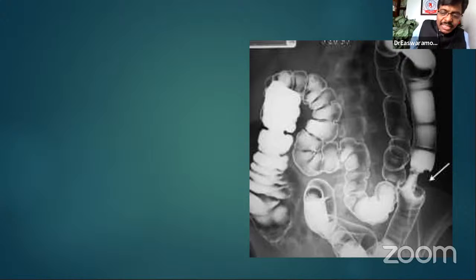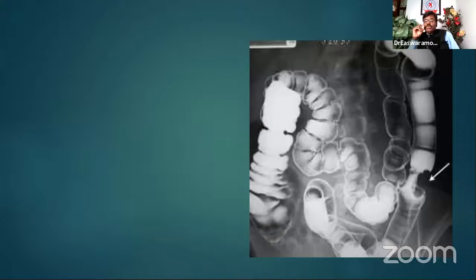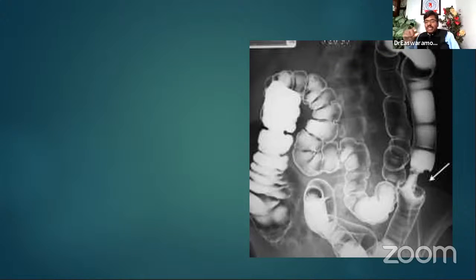Why? Can you do a CT scan tomorrow in this patient? No, sir, we can't do it. Okay, so you have to wait, five or six days, for CT. If the patient comes tomorrow with this picture, you tell the patient, because of barium, I can't do any investigation for that matter. You give them bowel preparation. Give polyethylene glycol. In a few days, his bowel will be cleared of all the barium. Then you do a colonoscopy and biopsy. Then it will confirm the diagnosis.